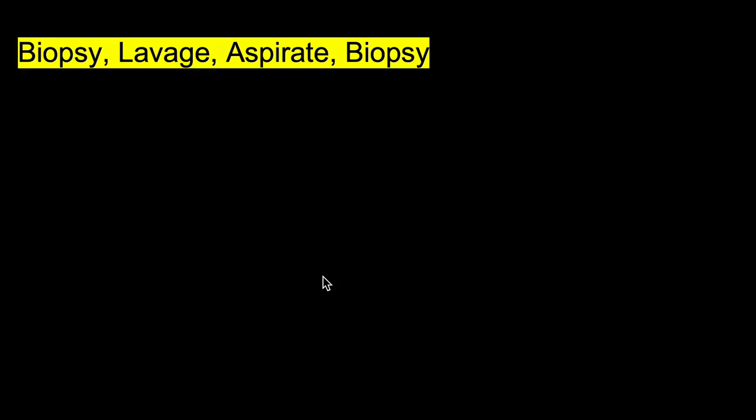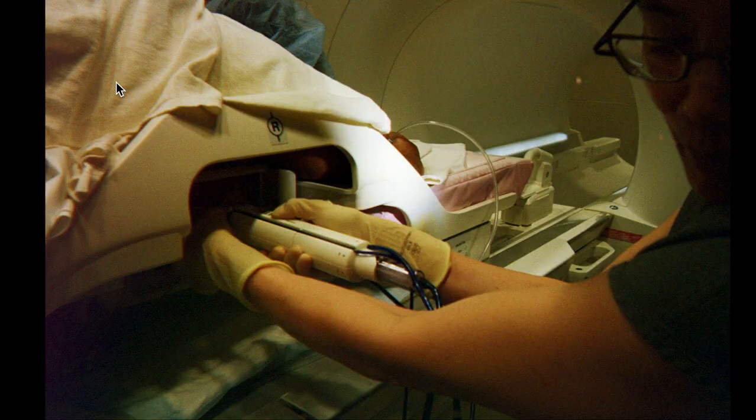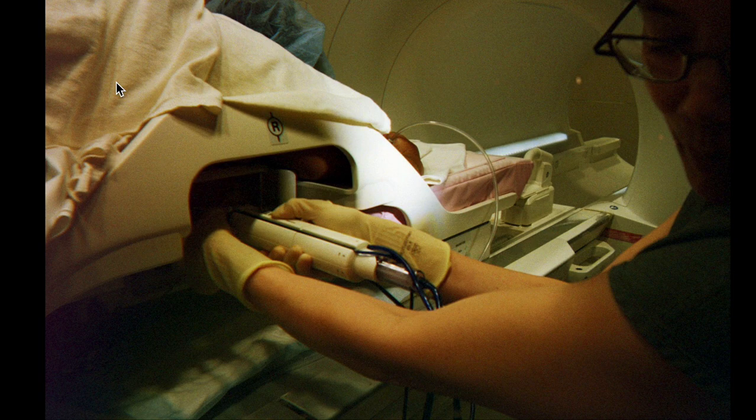When I'm done with that, it's set on biopsy when that is on, so I ask the tech to set it on lavage. She presses a button to put it on lavage, and then I am lavaging, so water's going in and getting flushed and pulled out. That's lavage.